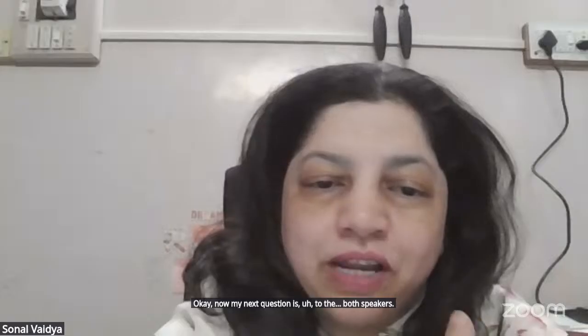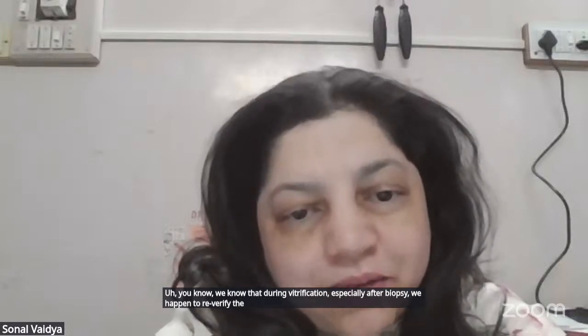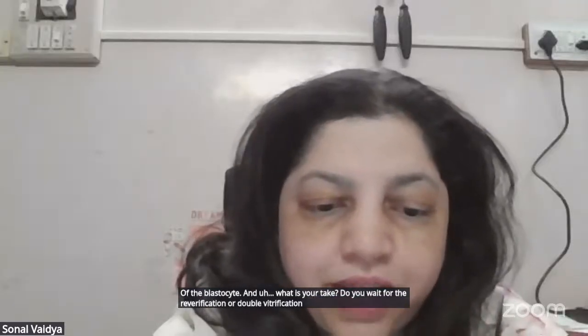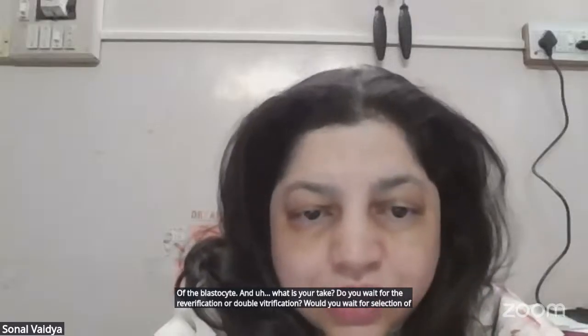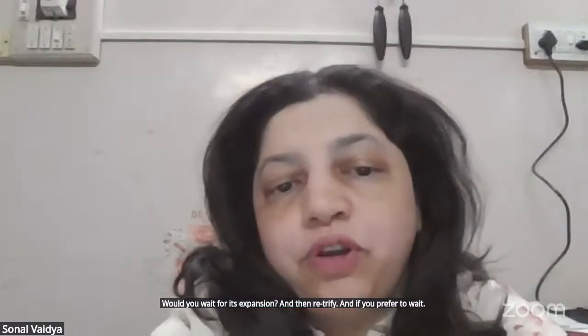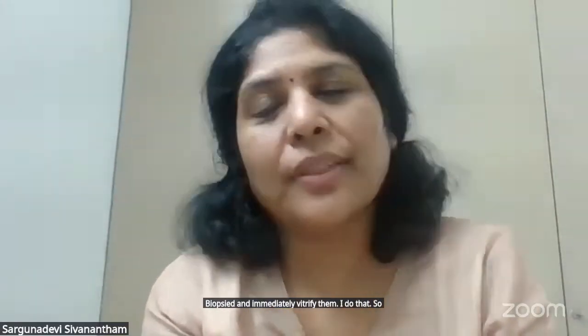Now my next question is to both speakers. We know that after biopsy, we re-vitrify the embryos immediately because of the collapse of the blastocyst. What is your take? Do you wait for the re-vitrification or double vitrification? Would you wait for expansion and then re-vitrify? And if you prefer to wait, would you wait for day 6, day 7? What is your protocol? In our laboratory, the embryos are biopsied and immediately vitrified. I load onto the vitrification ES solution, and then I go for loading onto the tubing. This is how I do it.